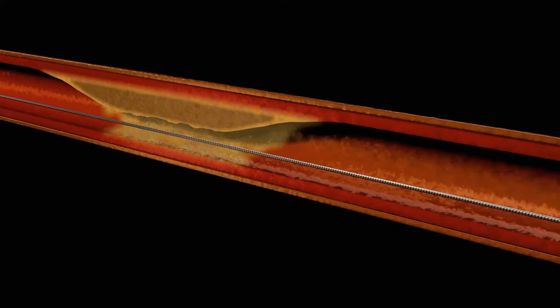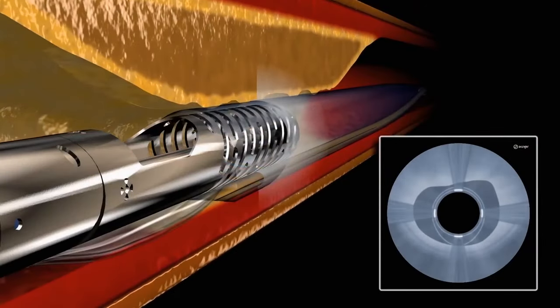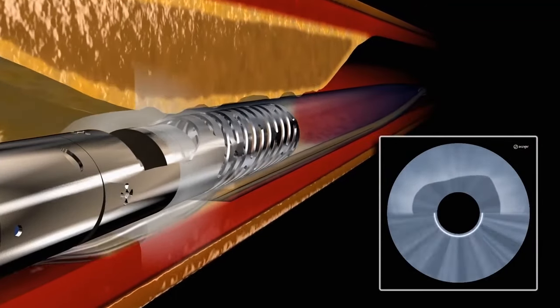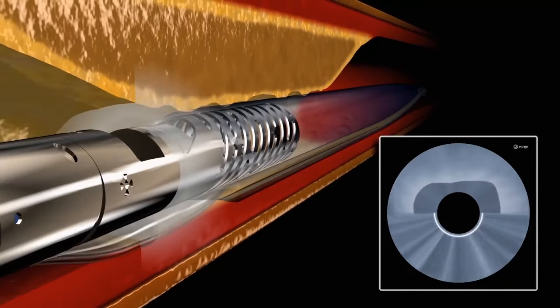The Pantheris device family runs on a monorail system and is indicated for both small and large vessels between 2 to 7 mm in diameter.